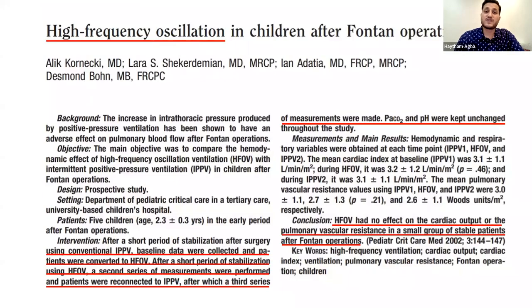The same study was repeated in Canada, but using high frequency oscillatory ventilation. They compared the same patient after using intermittent conventional mechanical ventilation and then switched the patient to high frequency oscillatory ventilation. But they found there is no effect on cardiac output, no effect on pulmonary vascular resistance in both groups. Maybe the difference between the two studies is that the previous one used high frequency jet ventilation, which used a lower mean airway pressure than high frequency oscillatory ventilation.